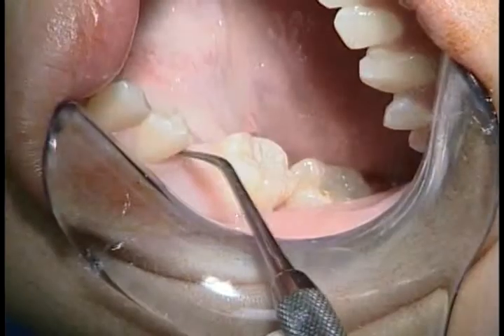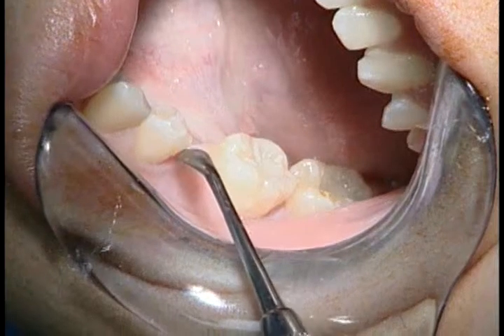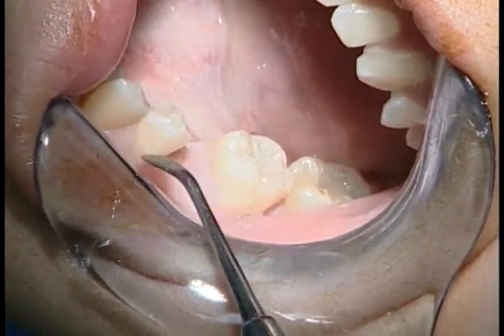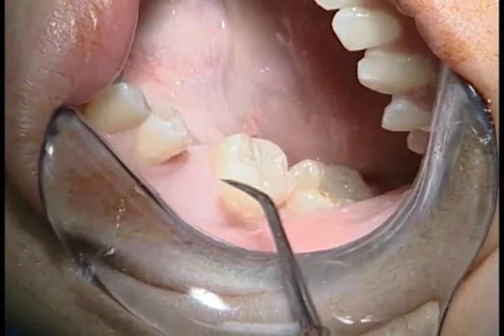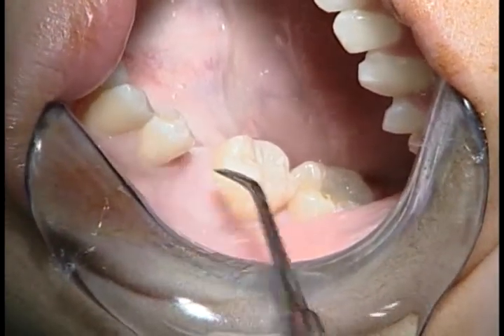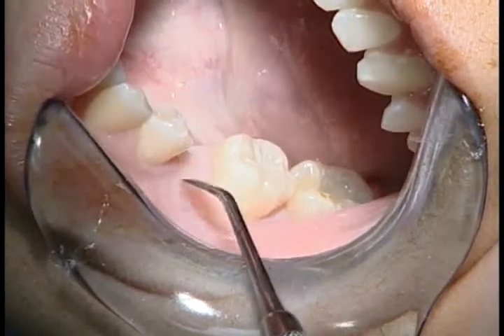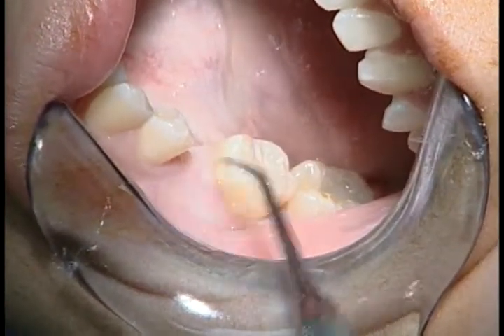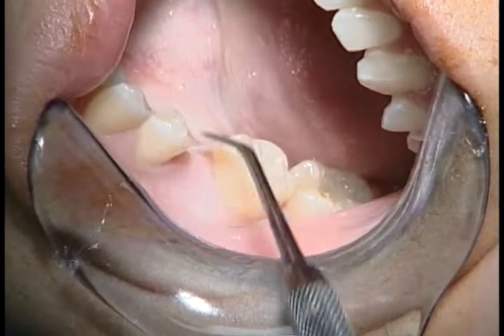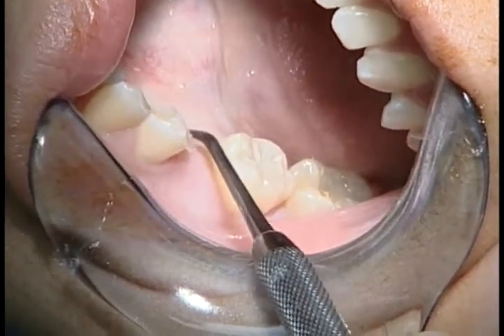Prior to the beginning of the actual surgery, the surgeon should be thinking and anticipating the surgery from the beginning to the end of the case. One of the most important parts of a surgical case is flap design. The proper incision will set up the case for proper blood supply and proper healing. The incision should be, whenever possible, a crestal incision in keratinized tissue with the anticipation of a full thickness flap.